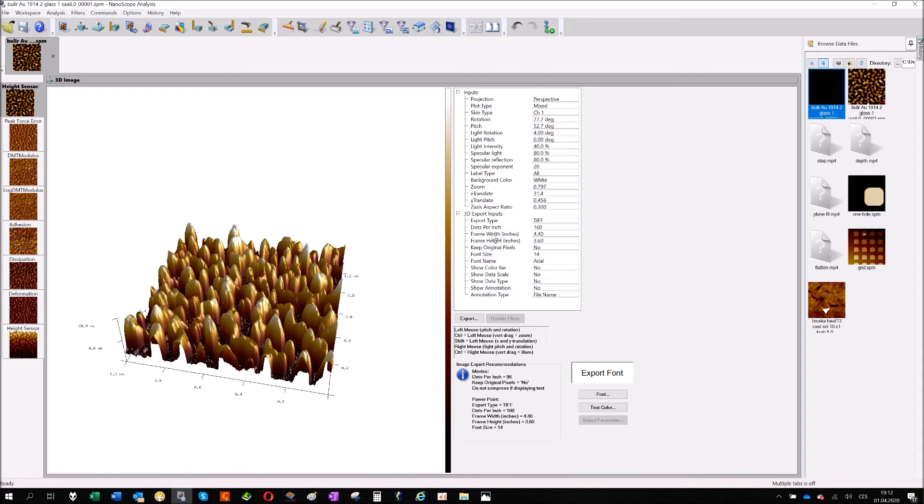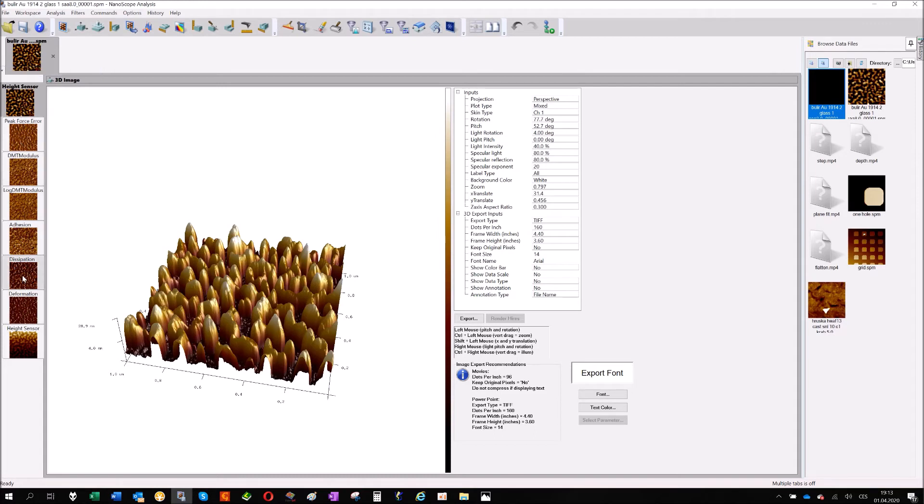But the most important part is that you can combine two kinds of information here in the graph. You can see that the image I have has multiple channels. It's from PeakForce tapping which enables to collect also the information about mechanical data, so you have multiple channels here.